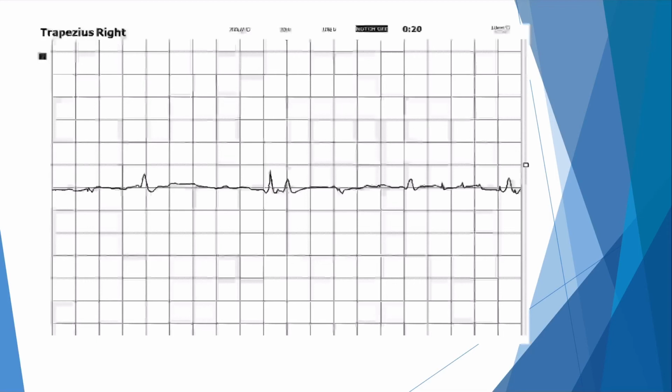When we think about motor neuropathies or motor fiber involvements, you've got to really think about motor neuronopathies, the anterior horn cell diseases. And so because they've got right arm weakness, let's start at the top. I'm just going to show you a couple of EMG screen grabs really.